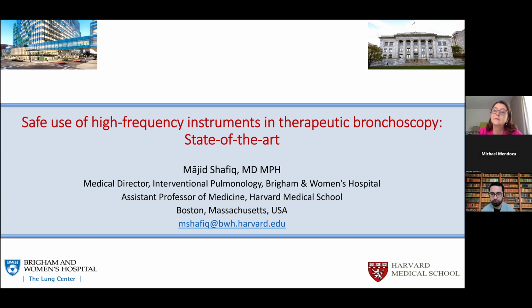and then bring out your forceps or your rigids. Now, if you are not using APC for any reason, and there are many reasons to not, supposing you don't have to, or you don't have it, or whatever have you, then yes, I think it's not unreasonable to use the rapid freezing to 30 seconds followed by a slow thawing process so that you get some degree of vasoconstriction locally, and then go ahead and perform mechanical debulking. I have done that very, very occasionally in a situation where, for whatever reason, I did not want to use APC at all. But really, I will say use it. I love where you're going with that. Use APC for that exactly. Good question.